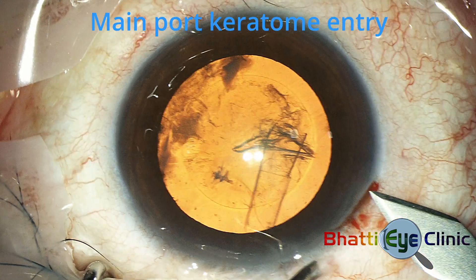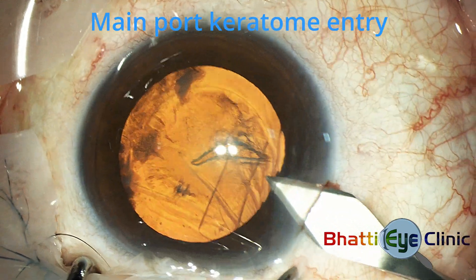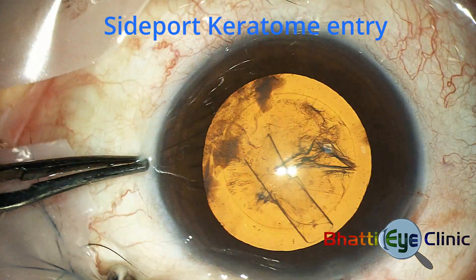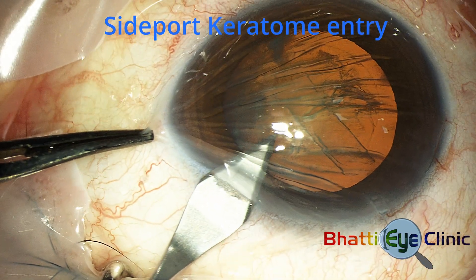A 2.8 mm keratome creates an entry into the anterior chamber about 30 to 40 degrees to the right of the midline, and the same keratome makes a side port entry on the left of midline, but this time the keratome enters only halfway of its total width, creating about a 2 mm entry.